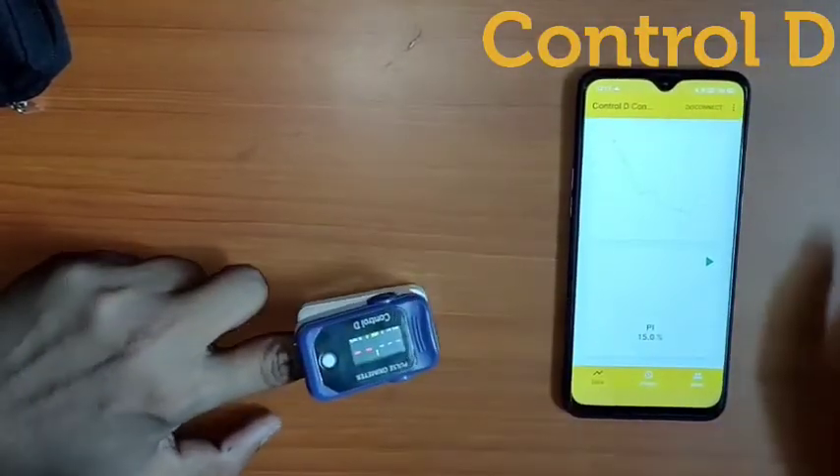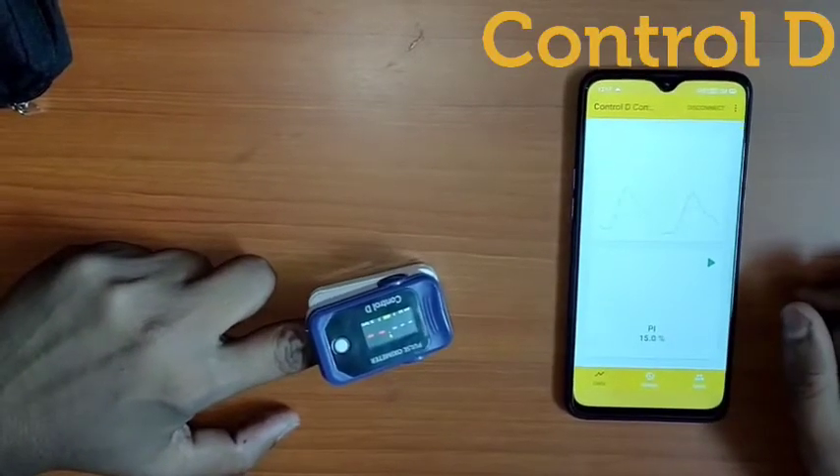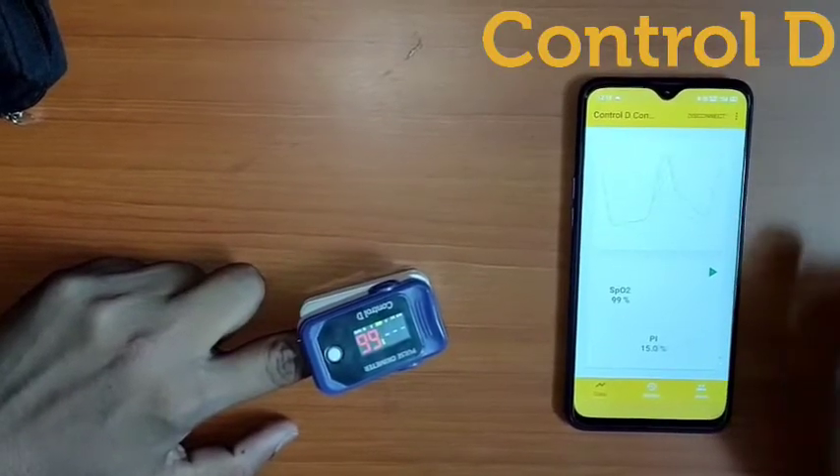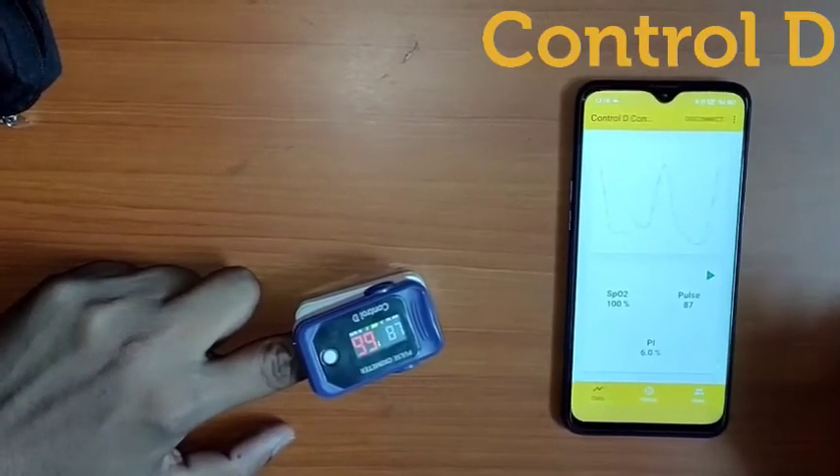Then put your finger inside the Oximeter and it will show your SpO2 and pulse reading. Stay healthy and stay safe.